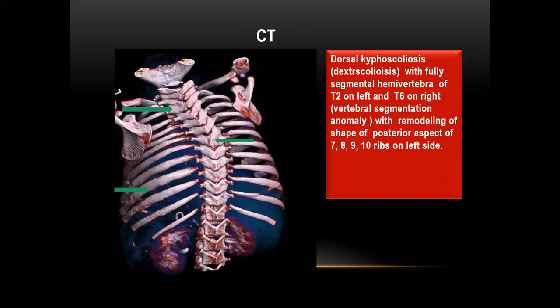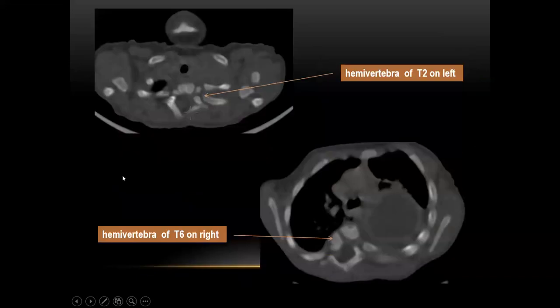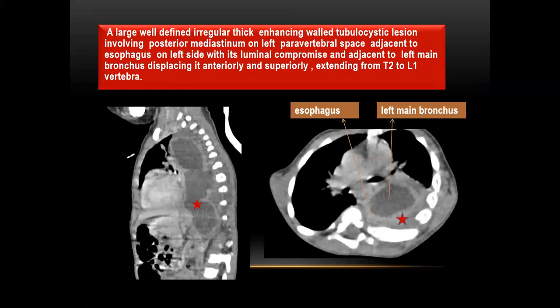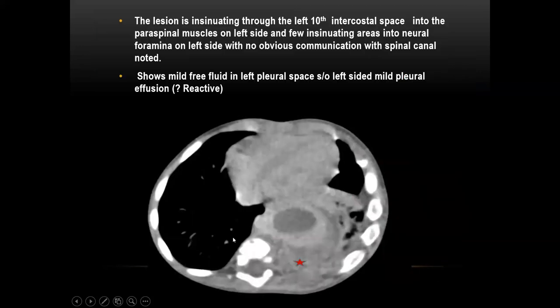The child underwent a CT scan which shows dorsal kyphoscoliosis with fully segmented hemivertebra of T2 on the left and T6 on the right — that is a vertebral segmentation anomaly — with remodeling of the posterior aspect of the 7th, 8th, 9th, and 10th ribs on the left side. An axial cut of the bone window shows hemivertebra of T2 on the left and T6 on the right. Also shows a large, well-defined, irregular, thick enhancing wall tubular cystic lesion in the posterior mediastinum in the left paravertebral space, adjacent to the esophagus on the left side, with the left main bronchus being displaced anteriorly and superiorly, and the lesion extending from T2 superiorly to L1 vertebra inferiorly. The lesion is insinuating through the left 10th intercostal space into the paraspinal muscles on the left side, with a few insinuating areas into the left neural foramina.